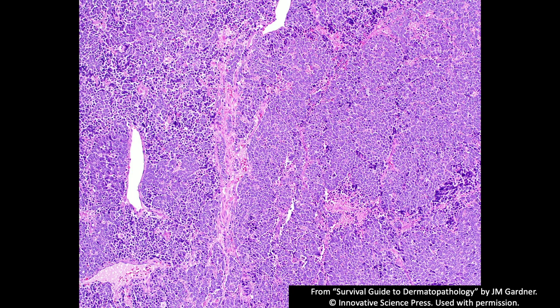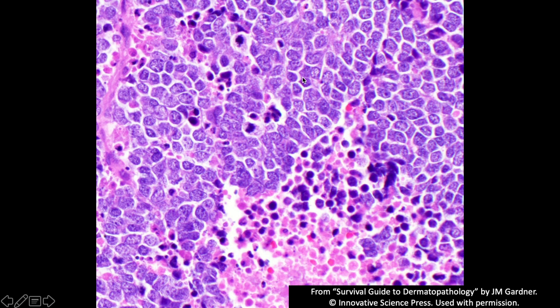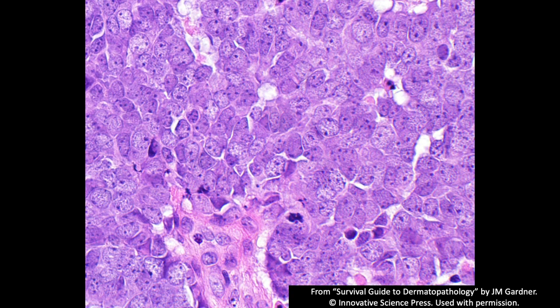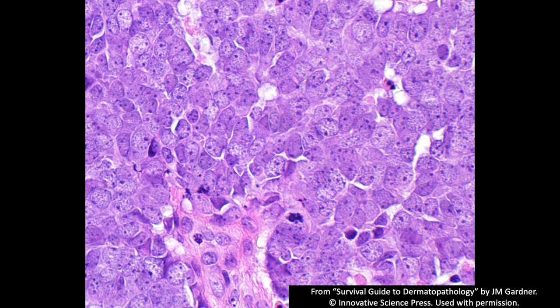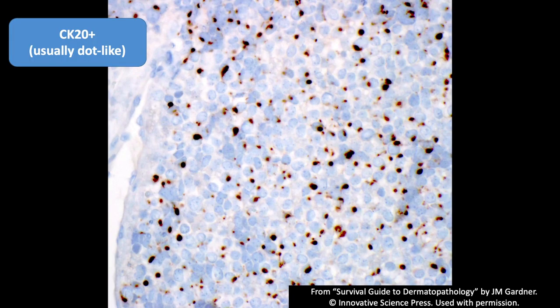Here's a blue basaloid tumor arranged in sheets with really no palisading and clefting at the periphery — nests are not well formed, very sheet-like and discohesive in areas, with lots of crushed cells, apoptotic cells, and necrosis. The tumor cells are molding against one another. In another example, the chromatin can look very granular, or very fine, smudgy, and dusty — salt-and-pepper. The key is the neuroendocrine pattern of chromatin, and mitoses are usually abundant. This, of course, is Merkel cell carcinoma.